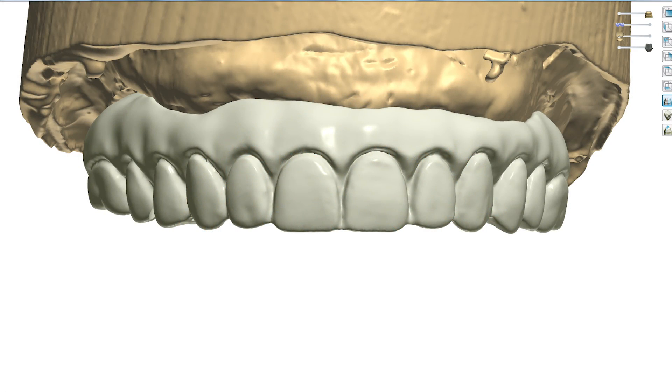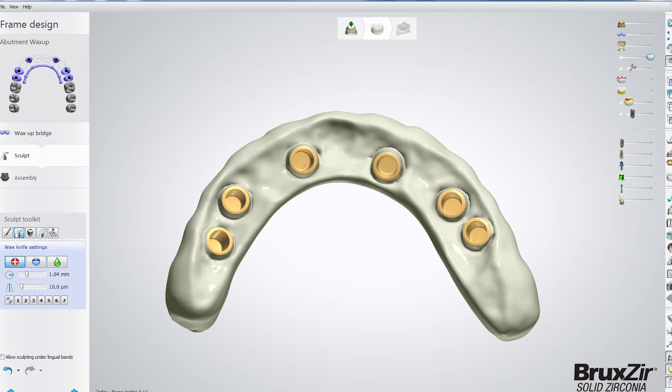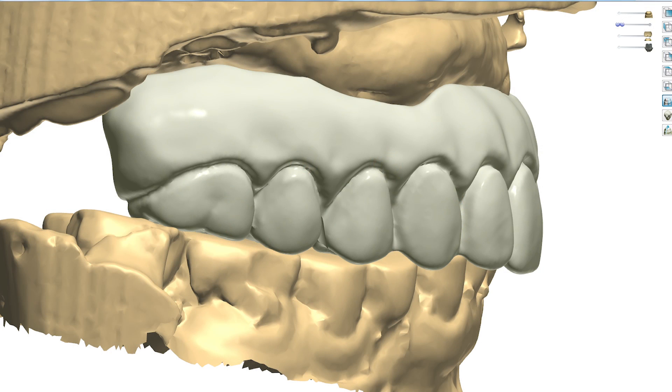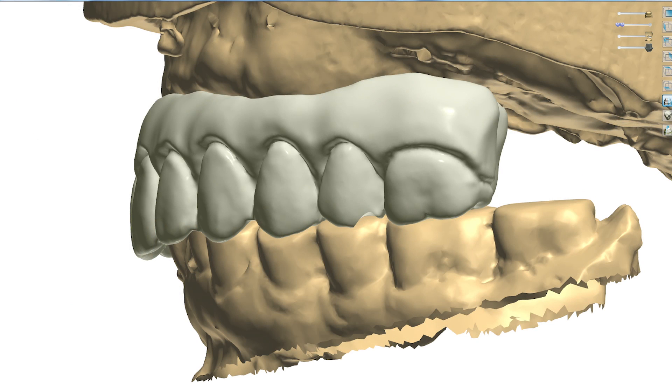Next, the dental lab scanned the final wax setup and definitive master cast, precisely capturing the doctor-approved setup and the exact positioning of the implants for CAD/CAM processing. CAD software was used to finalize the prosthetic design, ensuring a configuration that accommodates the positioning of the implants. The occlusion, jaw relationships, and teeth positioning were digitally verified as seen in Figures 20A, 20B, and 20C.